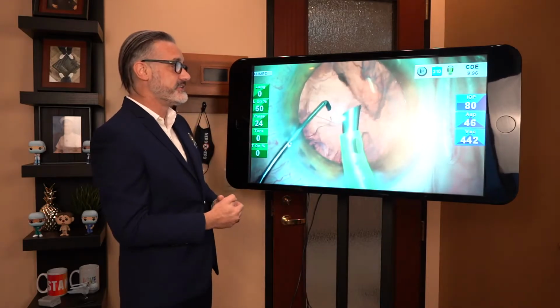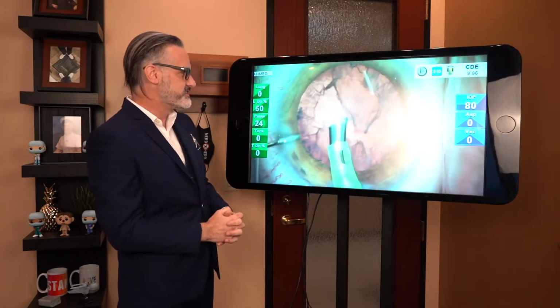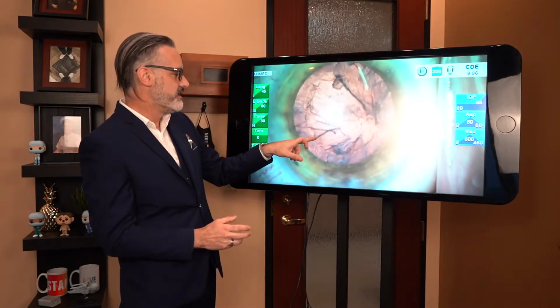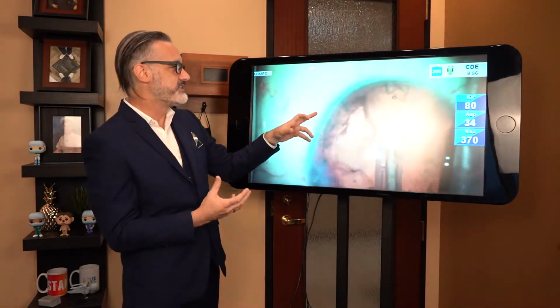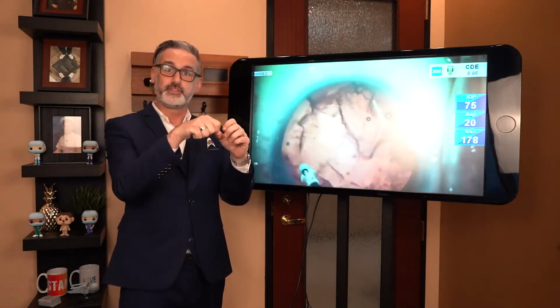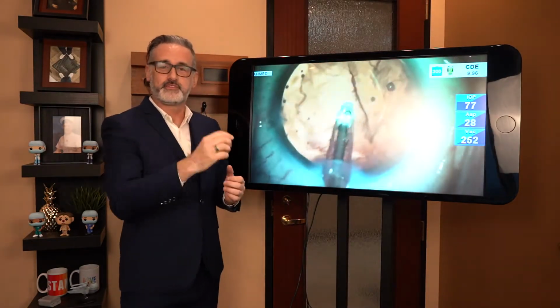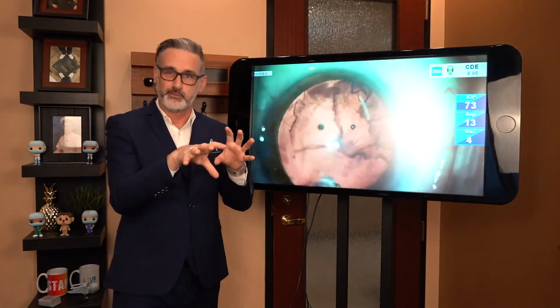All that's got to be cleaned out before the new lens can go in. So you're just going the suction around, and as we see there, we have a little bit left there. So then the doctor switched the tools, and just like you think of it as like you have your vacuum cleaner at home, and you have the different tools on the end, like the nose that you can extend out. Sometimes you have a little skinny line type of suction on the vacuum. A lot of times you put a little different accessory on the end, like a little brush on it.